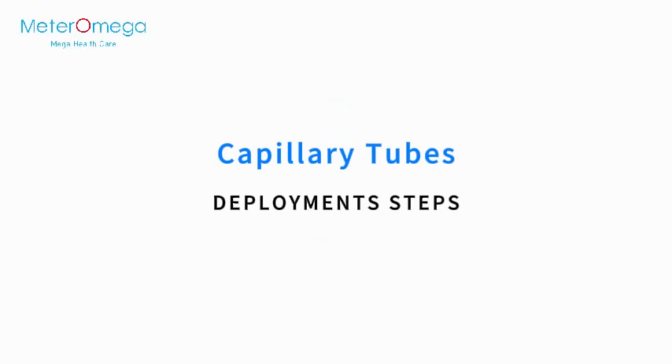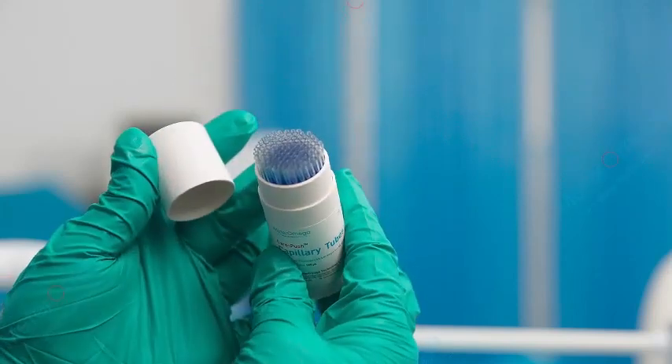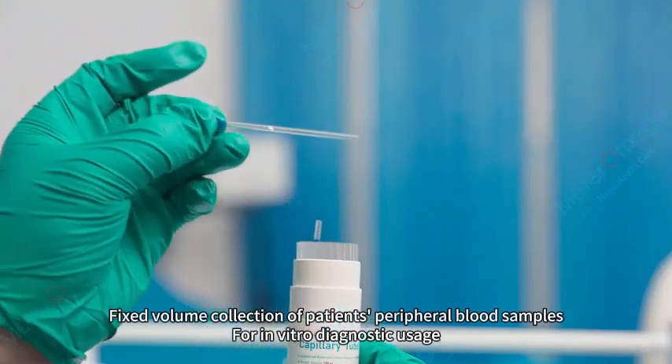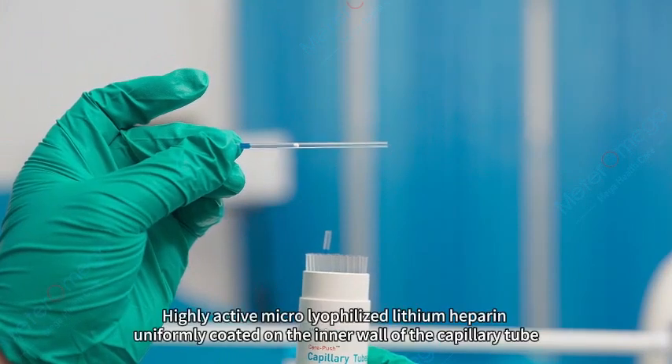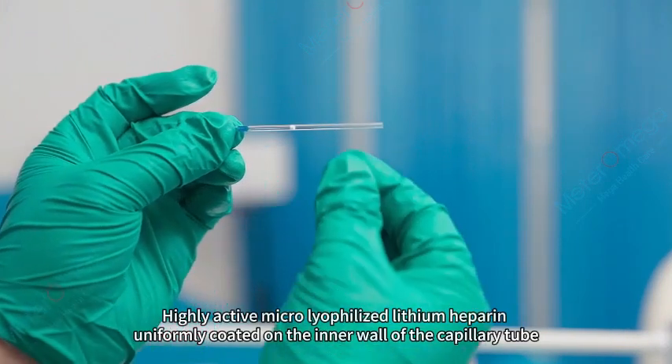Capillary tubes deployment steps: nursing staff need to be neatly dressed and hand sanitized, wearing masks and gloves. These capillary tubes are designed for fixed volume collection of patients' peripheral blood samples for in vitro diagnostic usage, using highly active micro-lyophilized lithium heparin.